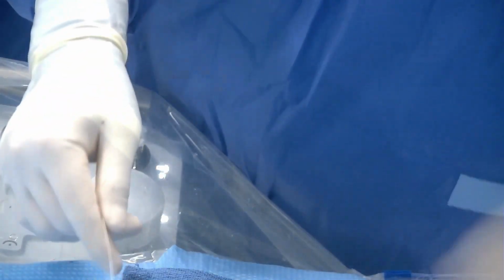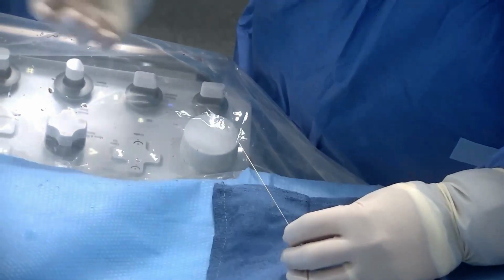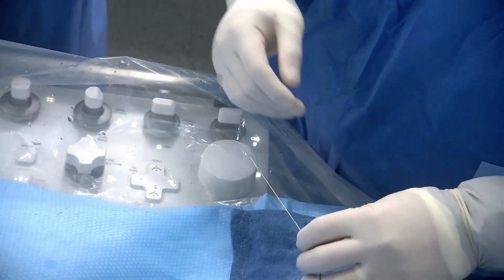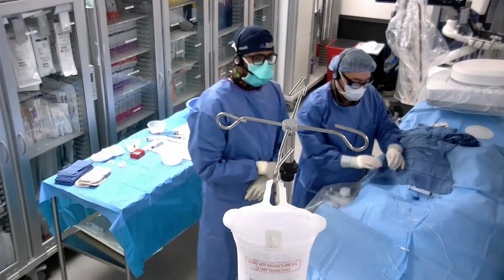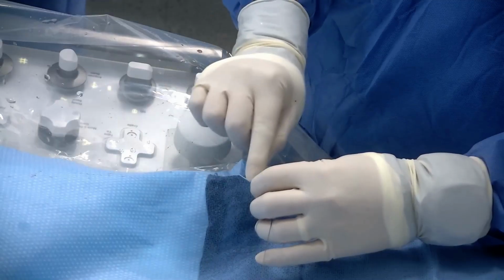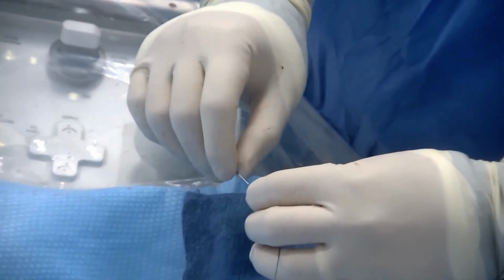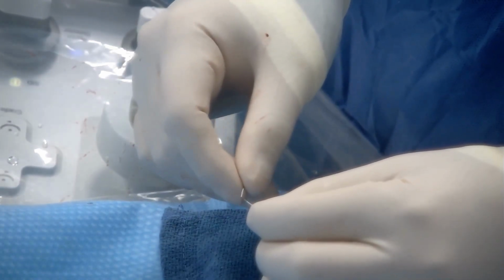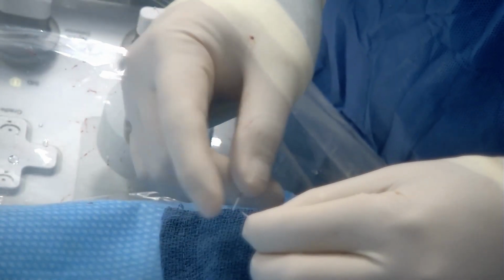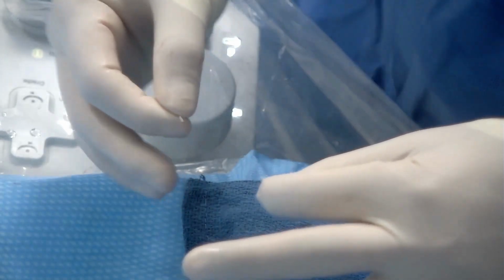And then the detachment mechanism, sometimes there's a separate handle involved or some other mechanism to deploy it. For this, there's really two white strips, and in between there is no white. That's where you break like this. You just snap it, and then there's an inner wire that will pull and detach.